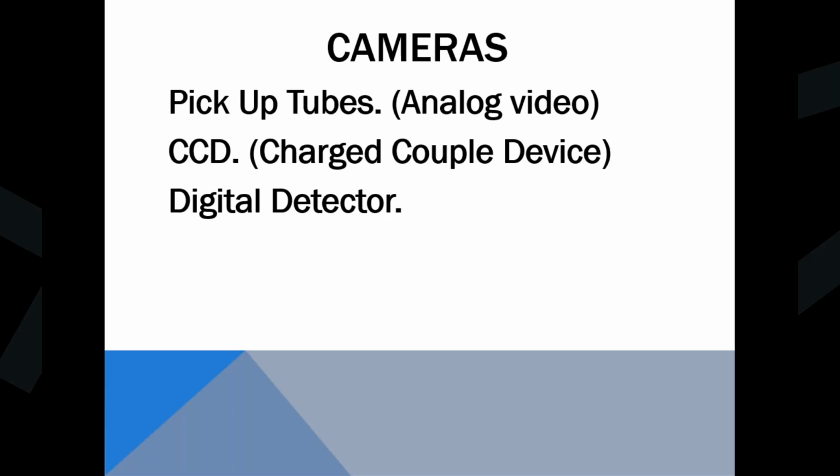About the 1980s, probably 90s, is when they came out with the charge coupled device. And so the charge coupled device was a solid state camera. They still use CCDs. You'll still see them on some of the older C-arms in the OR.